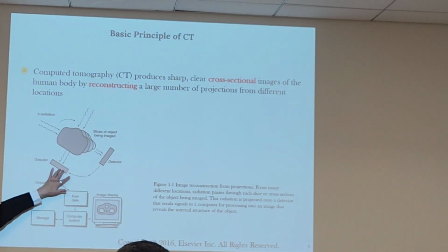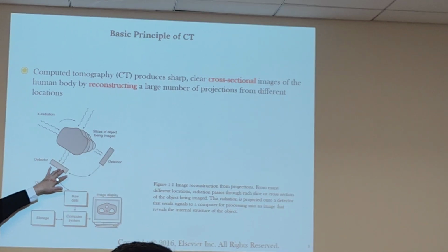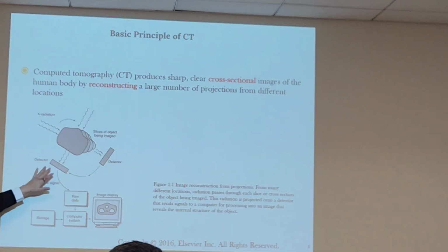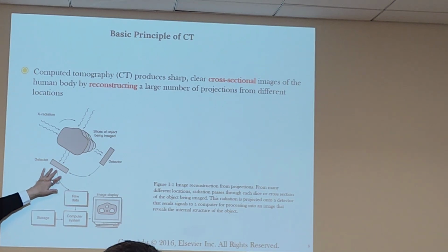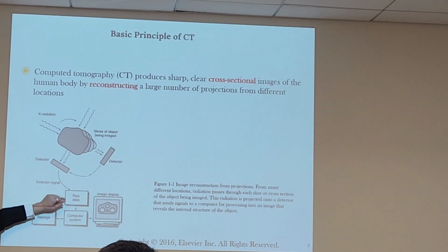So the detectors do what? Capture. Capture what? X-ray. In the detectors, now you have kind of like the imaging of the digital units of X-ray. You're able to now take the analog energy, convert it into an electrical signal, and then into digital data, or electrical signal, really.